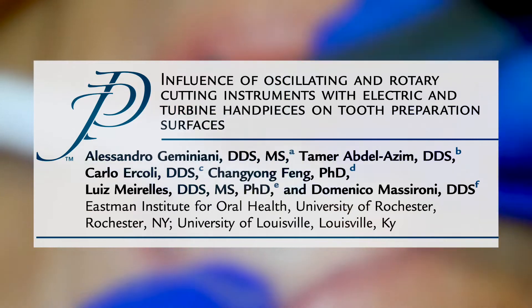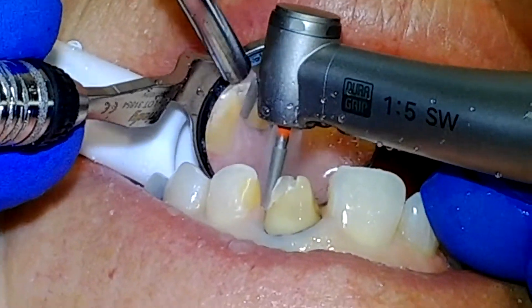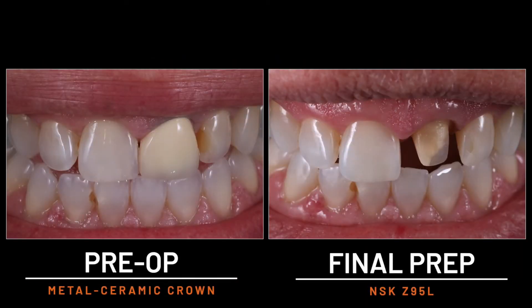We also know from the literature that compared to air turbine handpieces, much smoother and consistent tooth surfaces are achieved when electric handpieces are used, regardless of the diamond grit of the burr. Less hand fatigue, smooth margins, and glossy tooth surfaces are common factors in the operator experience when the need arises to remove existing anterior restorations with the Z95L electric handpiece.